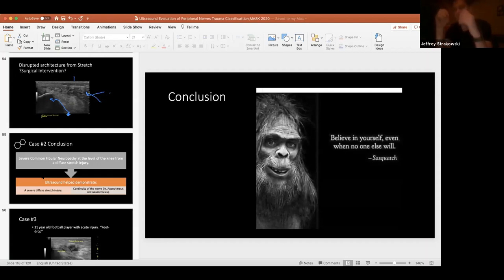So if I had a nerve that was a bifid in the forearm and it measured 8 millimeters squared, and then they came apart, and this one was 5 and this one was 4, you combine it, it's 9 millimeters squared. That would still be normal, so there's no enlargement. But if this is 6 and this is 6, that's 12. That would be abnormal. That means we've got enlargement.